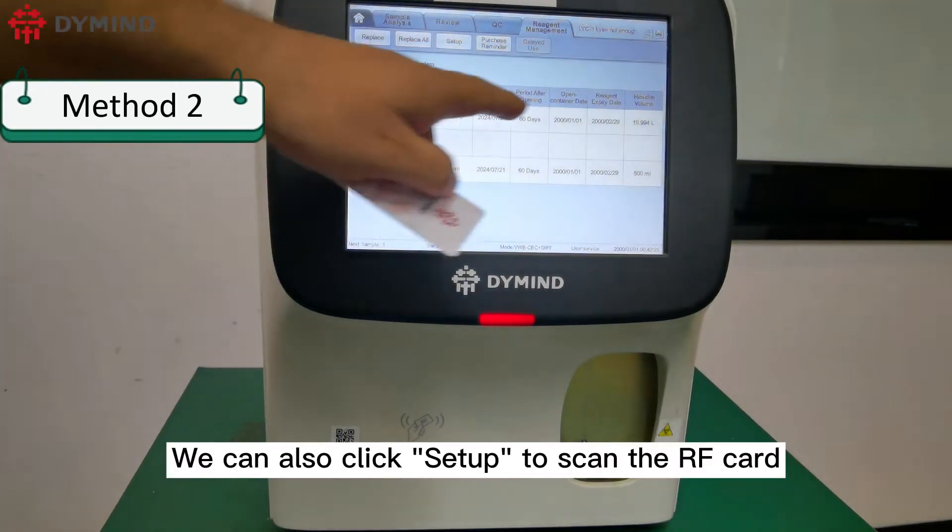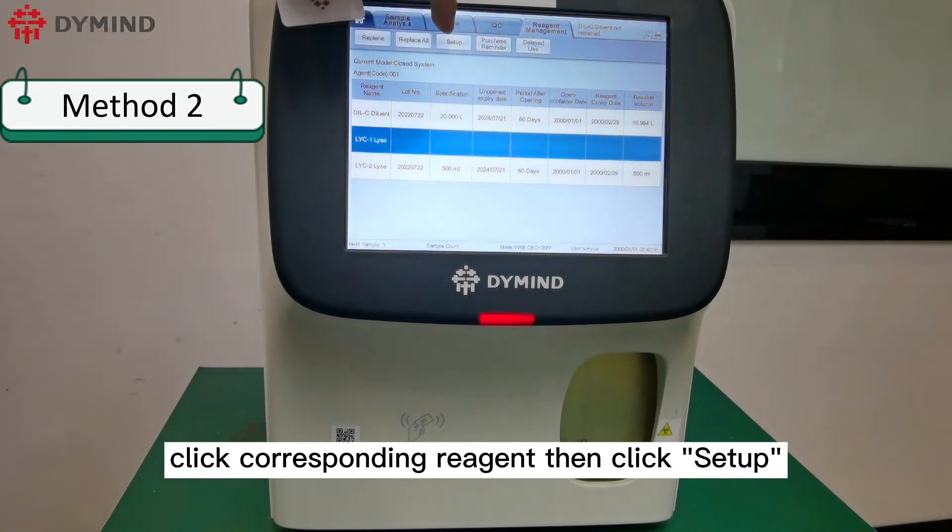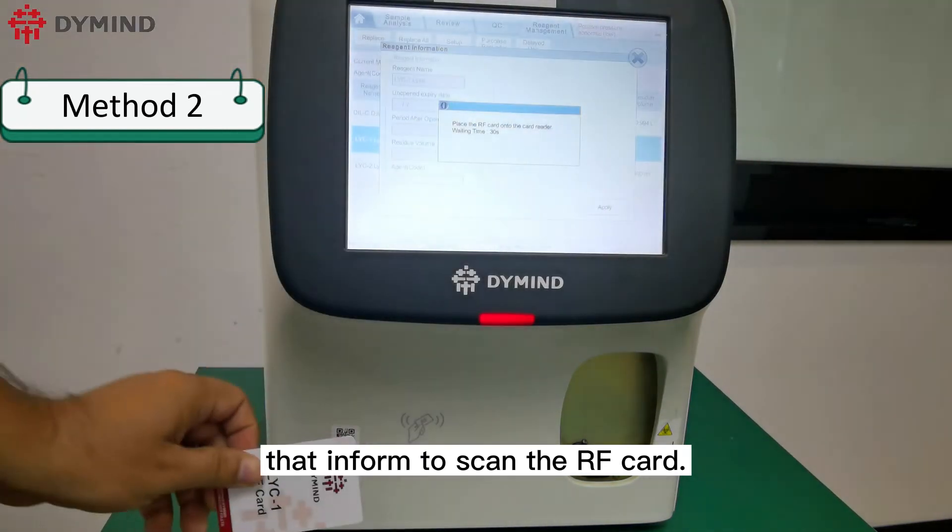We can also click Setup to scan the RF card. Click the corresponding reagent, then click Setup. The analyzer will jump out the message informing you to scan the RF card.